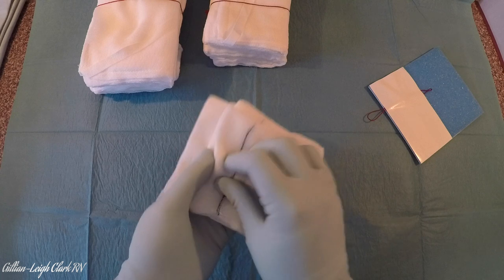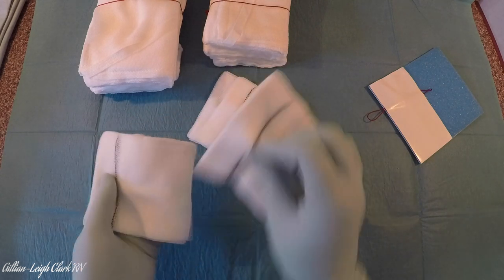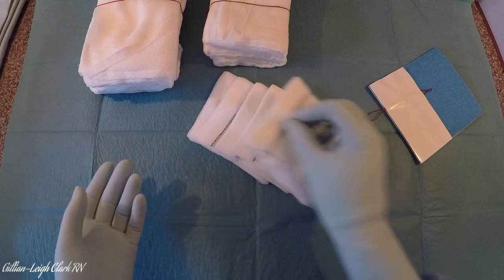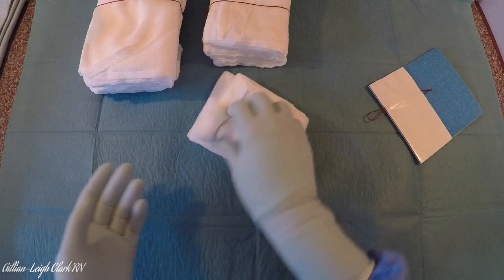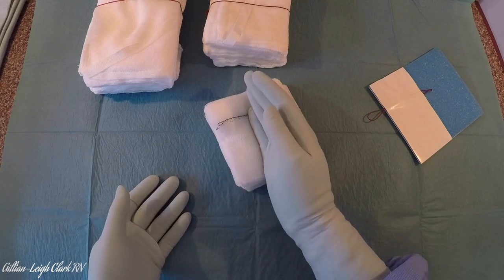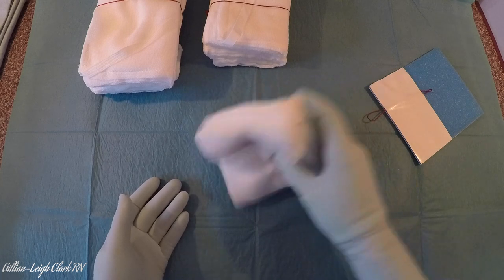You can fan them out — it doesn't matter: 1, 2, 3, 4, 5 — whichever you prefer. For space, it's quite often easier to have them in a little bundle, but you must never count a second bundle on top of the first bundle. They must be counted in separate fives. There you have your small swabs.